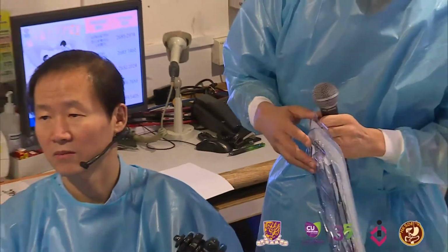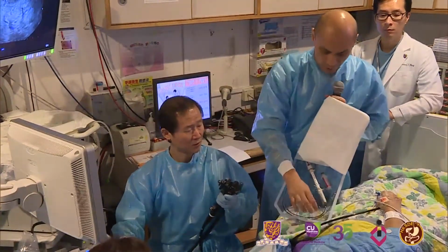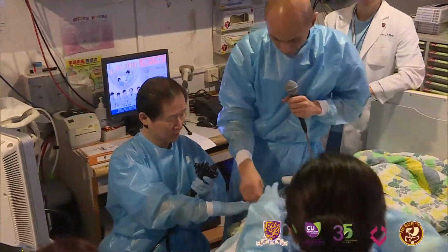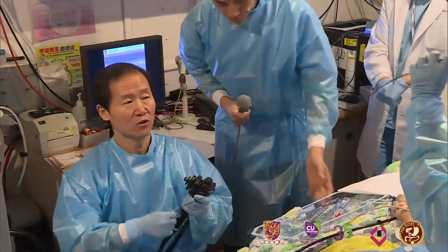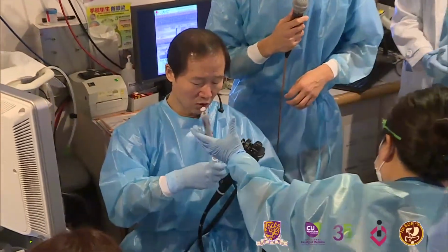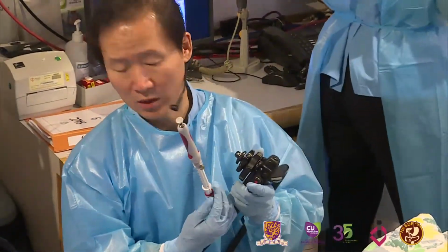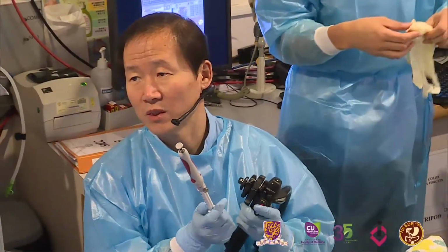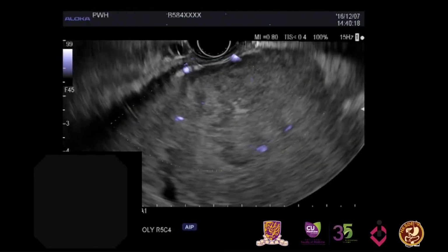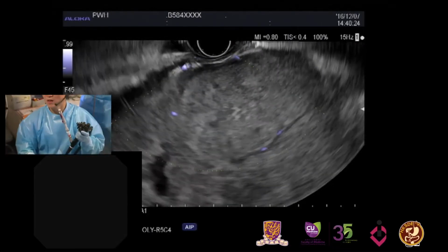Nowadays, we are also asking our pathologists to not only do the immunohistochemistry, but at the same time also ask for mitotic activity. So it's possible. Generally, my standard needle is a 22 gauge needle, but this is 20, so a little bit thicker than the usual needle, but it shows pretty good flexibility. But one thing we need to be careful about is that this is a relatively thicker needle, so if this needle punctures a vessel, then the field will be very bloody. So try not to puncture the highly vascular area.